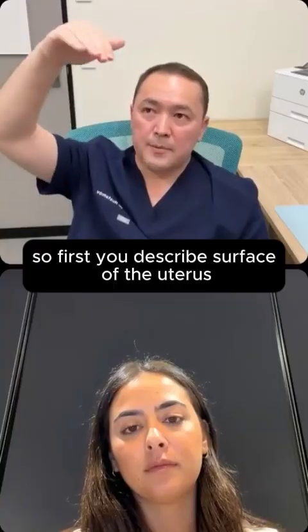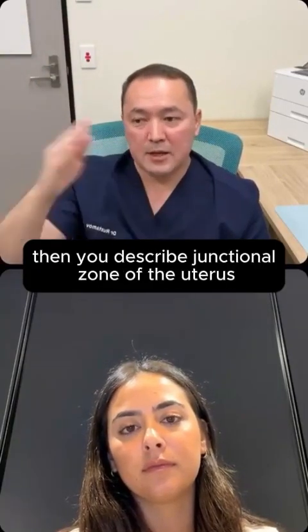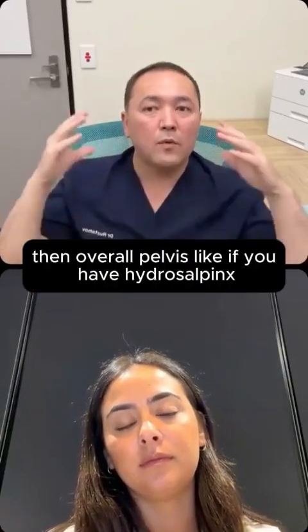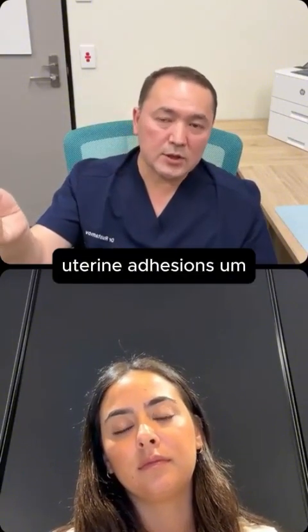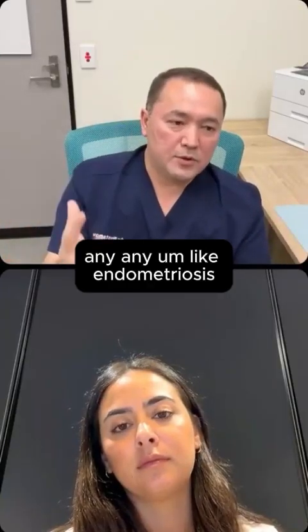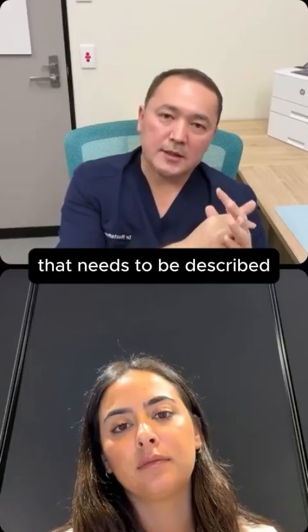First you describe the surface of the uterus, then the muscle of the uterus, then the junctional zone, then the endometrium, then the overall pelvis, like if you have hydrosalpinx, uterine adhesions, any endometriosis surrounding the uterus, and MUSA criteria that needs to be described.